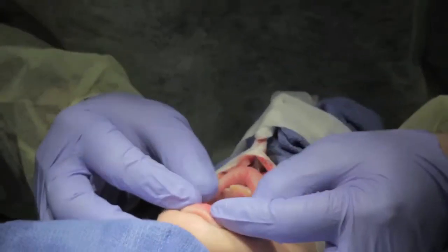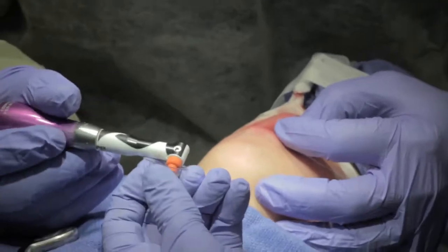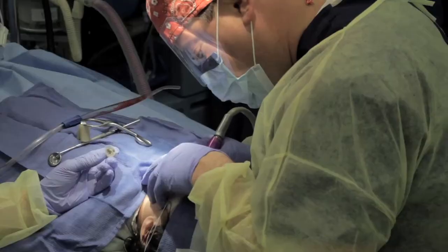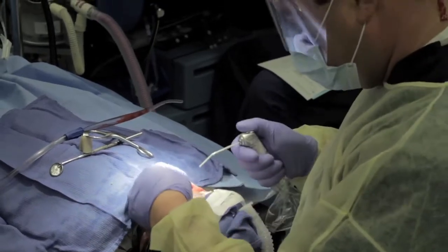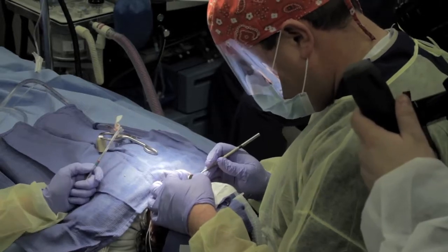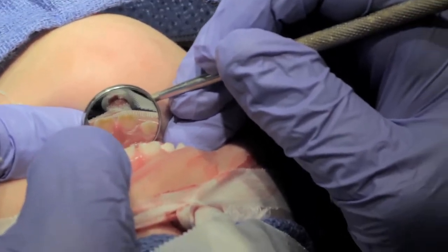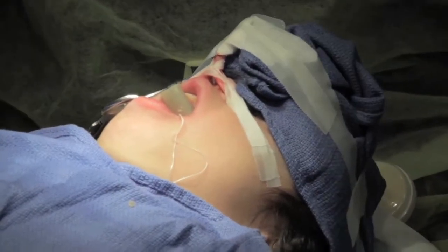Let's do a quick prophy. I'm just going to clean the teeth first so we know what we're dealing with. If you look at the linguals of those teeth, you can see pretty large lesions — it just wraps around facial, incisal, lingual caries. There's a couple small cavities in the back. We're just going to prep those real fast and then we'll do the front teeth.